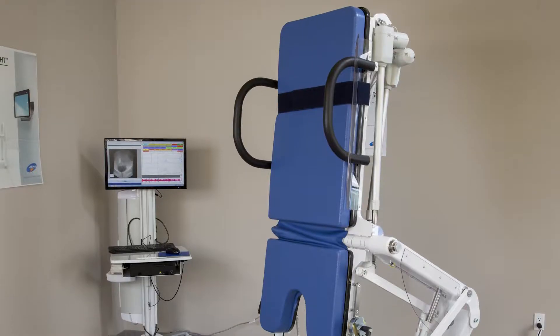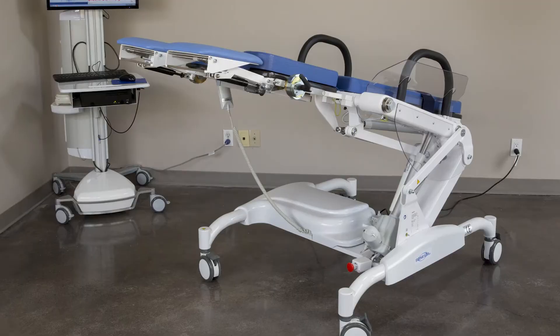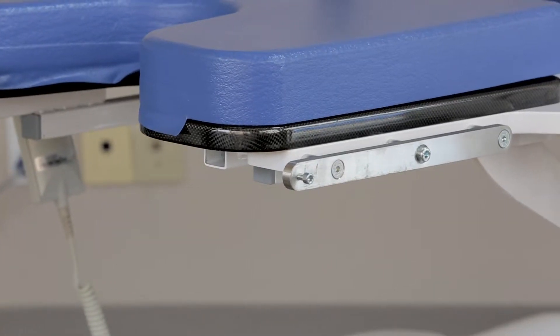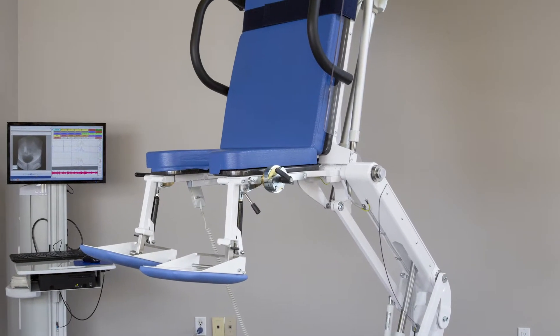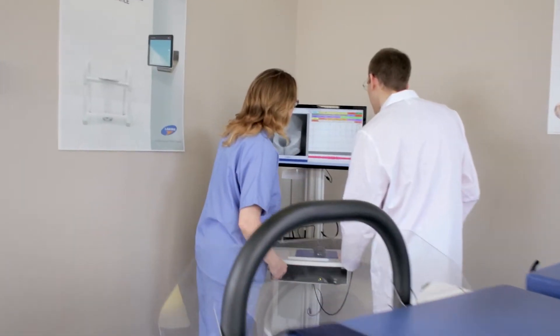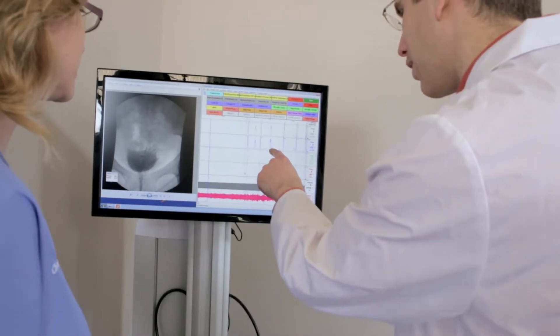Positions include standing, sitting, supine, and Trendelenburg. The unique carbon fiber back and seat plates allow for head-to-toe imaging, and the cantilever design offers easy C-arm access for anterior, posterior, lateral, and oblique views without obstruction.